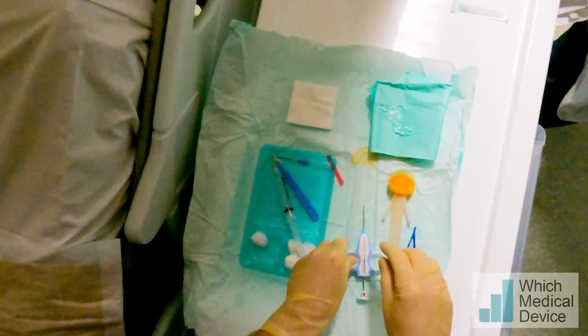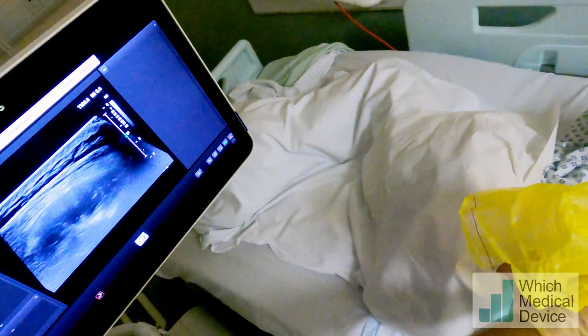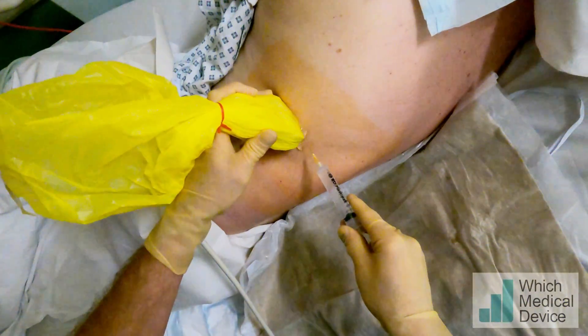So this is just the ultrasound back on your skin again and I'm going to put some local anaesthetic in as I explained. Right, it's a little sharp scratch now.